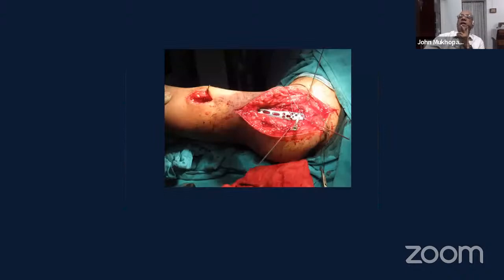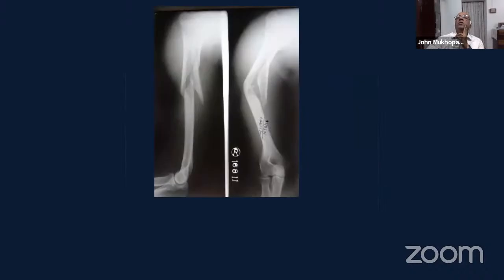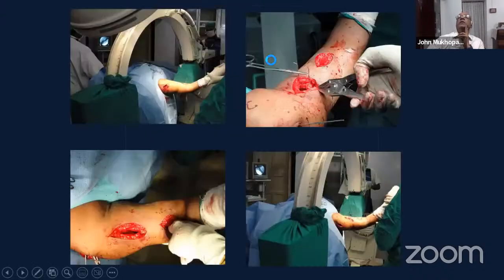You can just slide this plate down, and here you don't need to worry about the radial nerve so much because the plate is more anterior distally. You put multiple screws proximally and distally. And because the screws are in different directions, this also gives you a very stable fixation. So that goes on to heal well. Here's another case. Again, this is a shaft extending onto the proximal humerus.